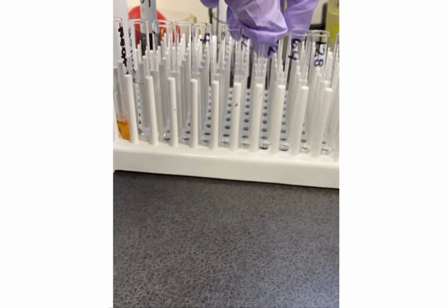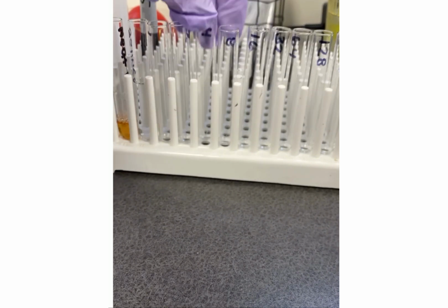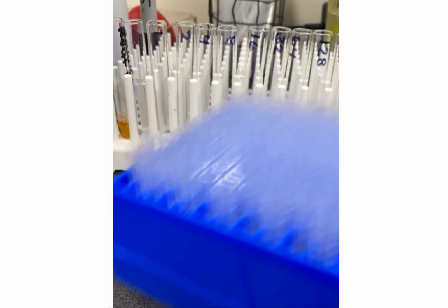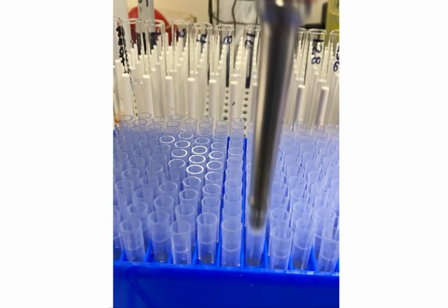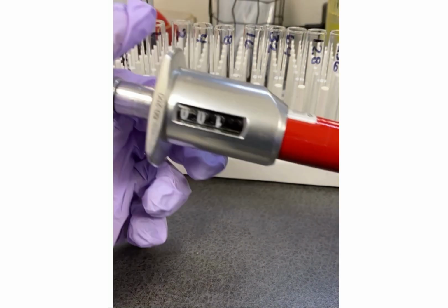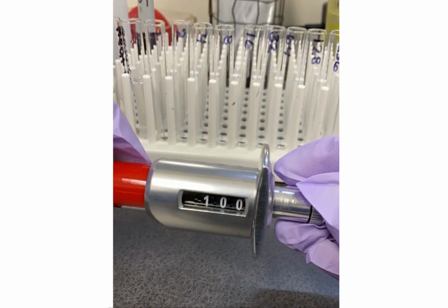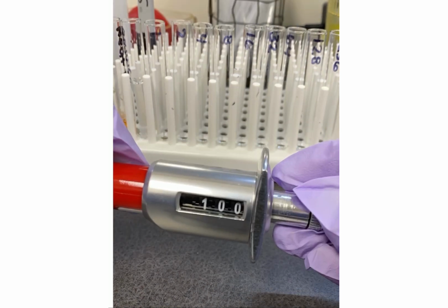Now that I've added saline to tubes 2 through 512, I'm going to add my patient plasma to begin my titration of serial dilutions. I'll need more than one pipette tip. We use separate pipette tips for each dilution to reduce carryover between mixing. I'll take a brand new pipette tip and I'll add 100 microliters of patient plasma to tube number 1. Recall that tube number 1 has no saline in the tube.